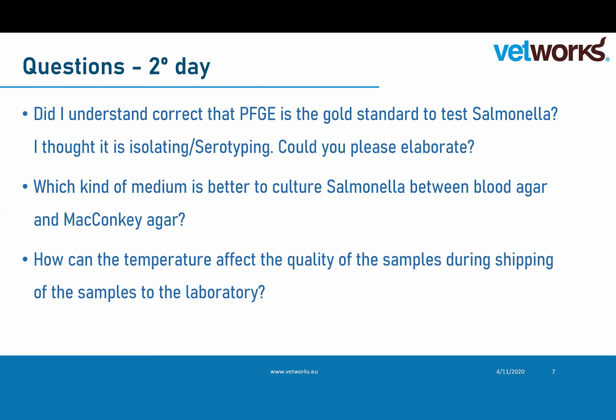But the standard to follow, I think, is this method that we indicated. The ISO method is still the best. And those chromogenic mediums are very useful because immediately you can see a color change and you can see this is a Salmonella. So that is very useful. You don't need to do a lot of other biochemical tests then.